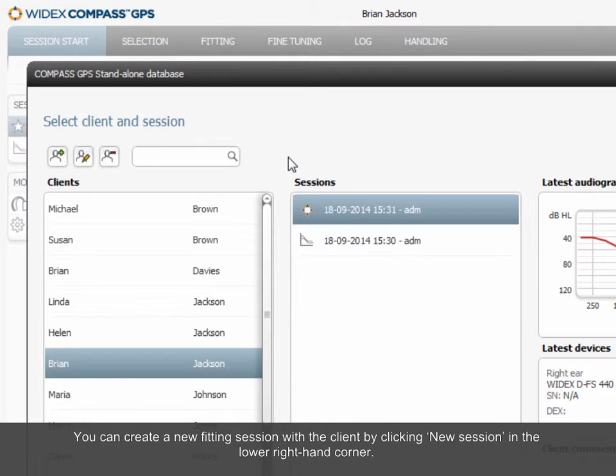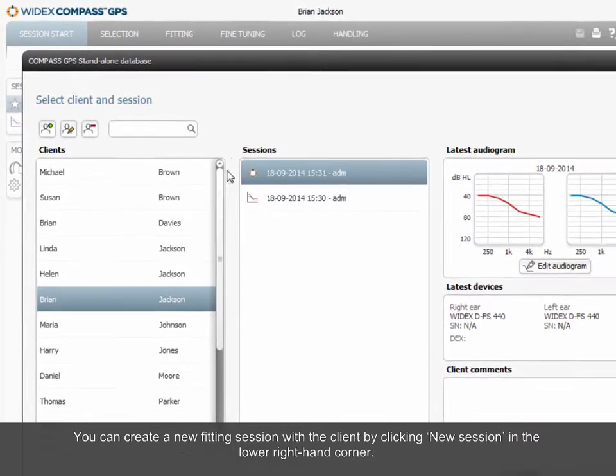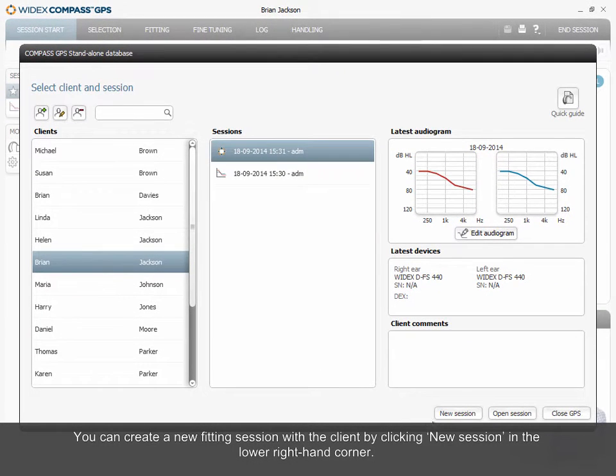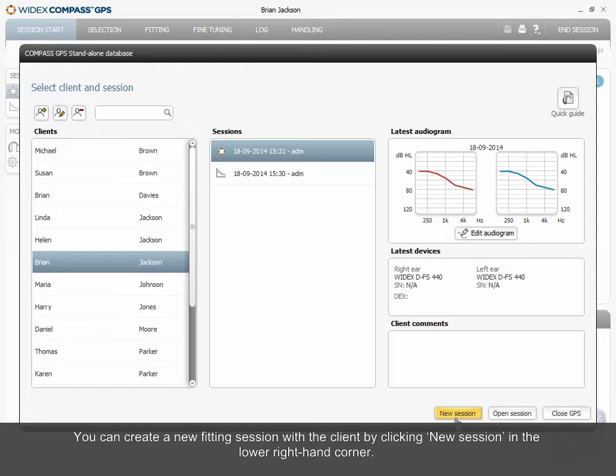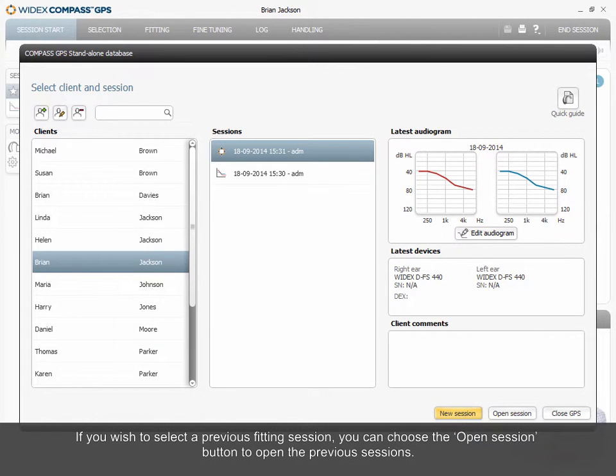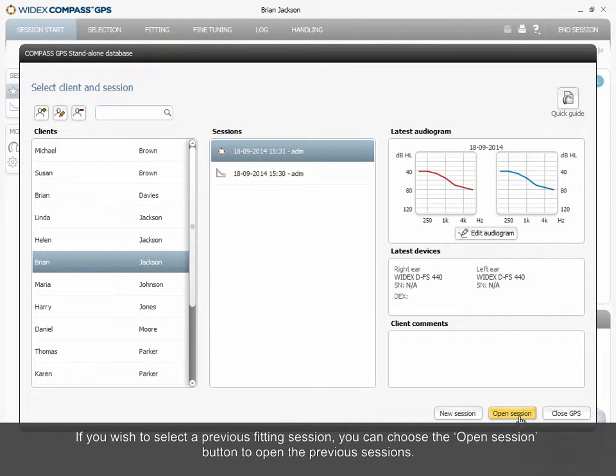You can create a new fitting session with the client by clicking New Session in the lower right-hand corner. If you wish to select a previous fitting session, you can choose the Open Session button to open the previous sessions.